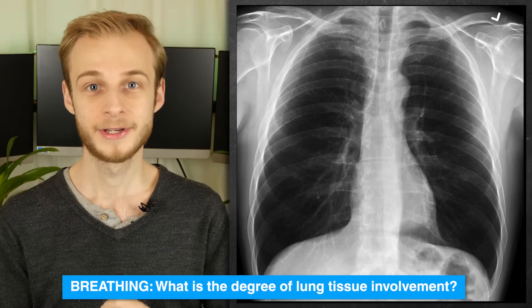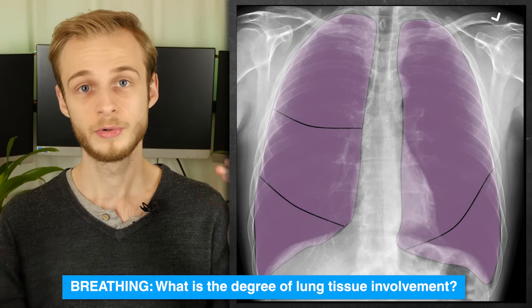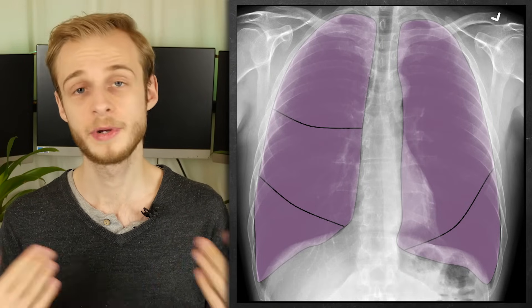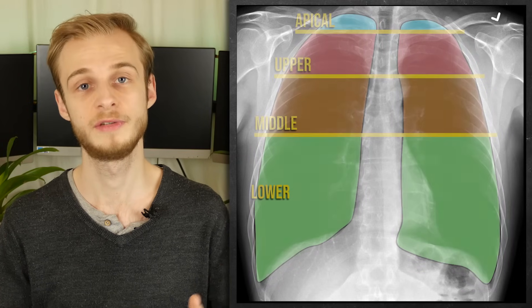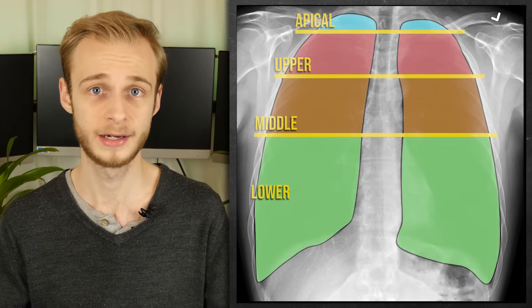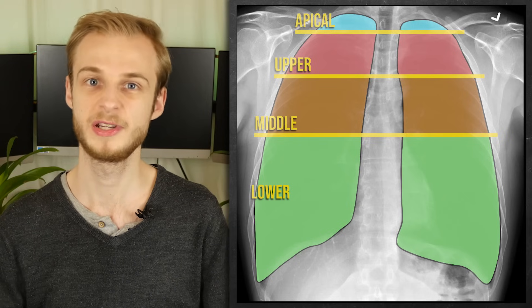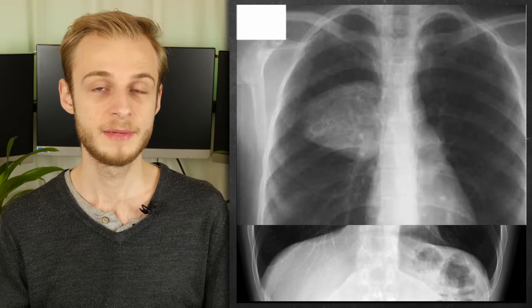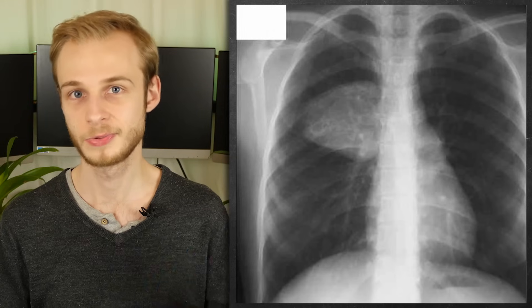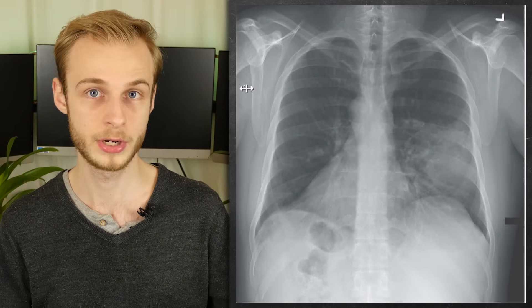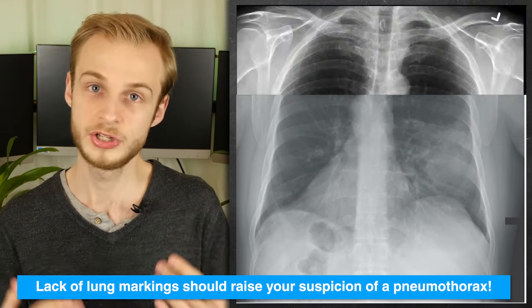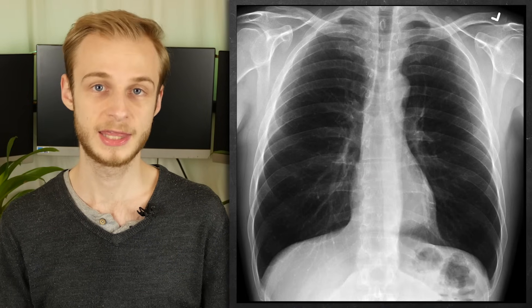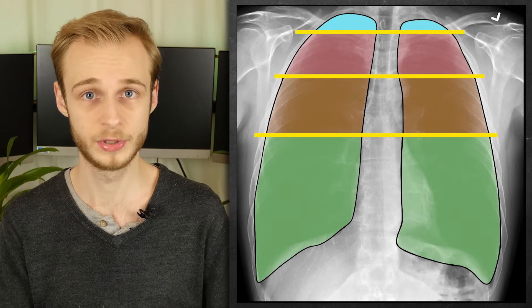B is for breathing, so now it's time to look at the lungs. We normally divide the lungs anatomically into different lobes, but on a chest x-ray we use zones for interpretation, which makes it easy to report where any finding is. For example, here is an image showing a mass in the right middle zone, and here is one showing a left middle zone pneumonia. If you can't see any lung markings at all, this should make you highly suspicious of a pneumothorax. It's also important to check the apices — the very tops of each lung — before you move on.